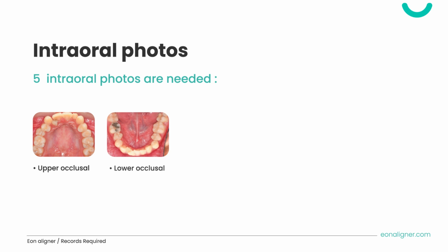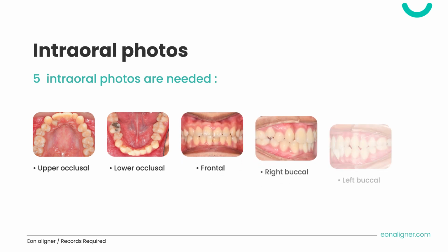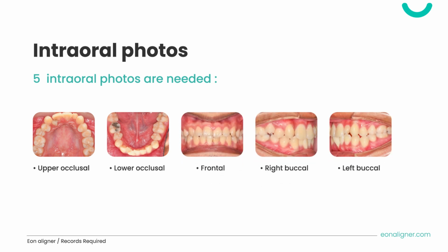Next is intraoral photos. 5 intraoral photos are needed to check the patient's teeth alignment, periodontal and restorative condition, bite and midline status, etc. The 5 views are upper occlusal, lower occlusal, frontal, right buccal, and left buccal.